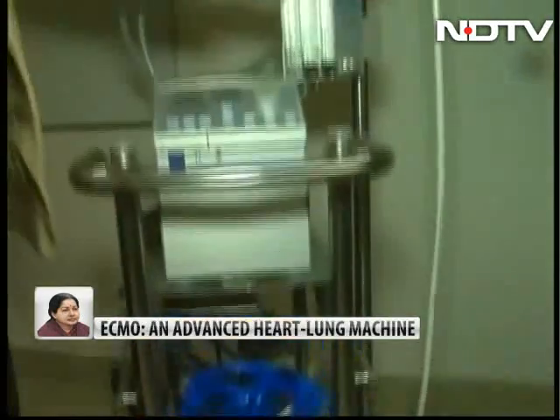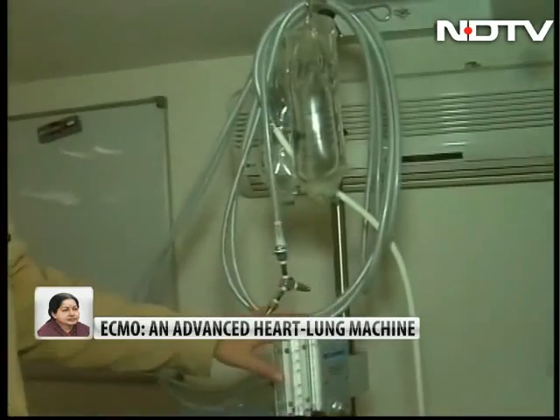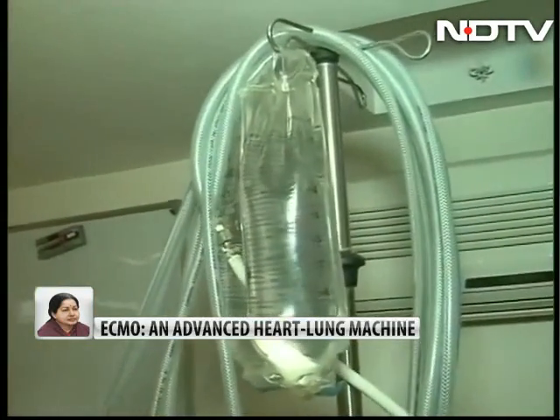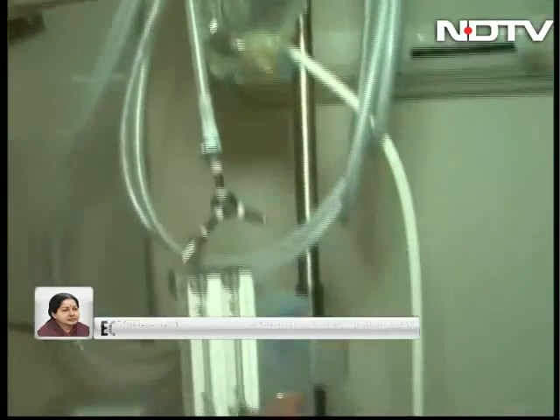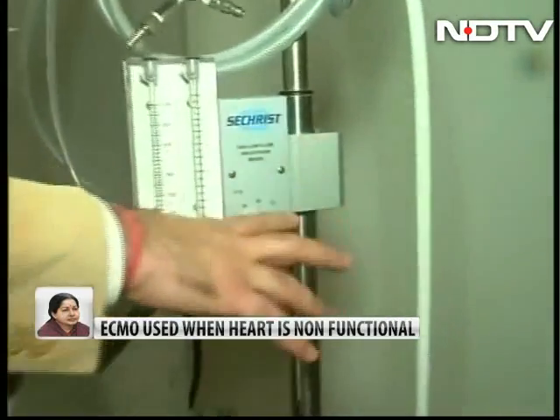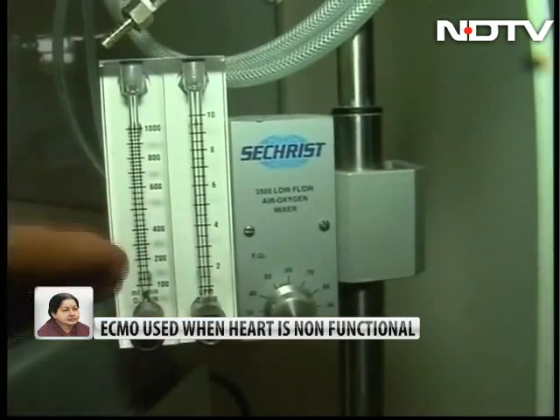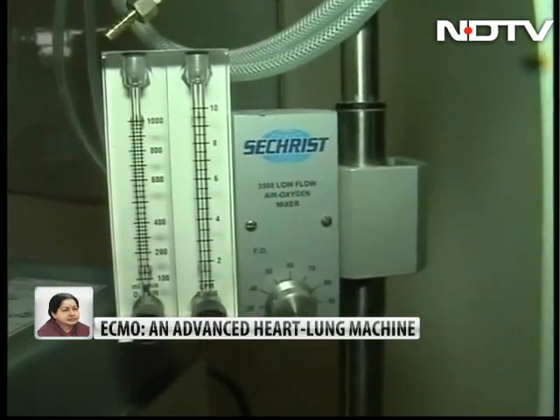This is where we control our oxygenation and the carbon dioxide. As you can see these numbers, you can give from 21% to 100% oxygen to the patient with this one, and these are the sweep gases, and these control your carbon dioxide levels in the patient.